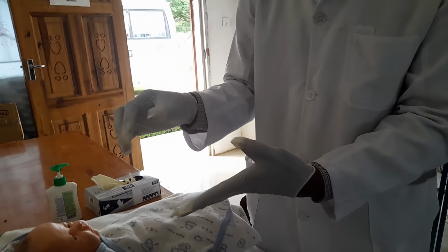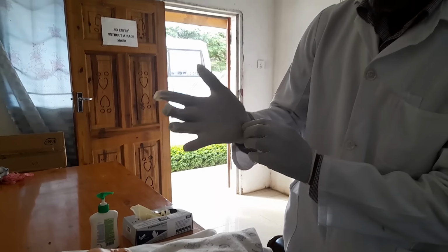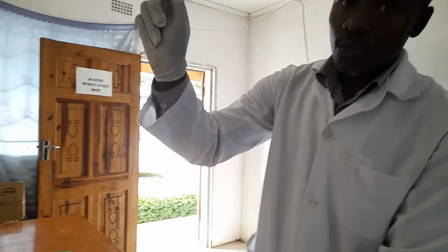In this case, the baby is on a resuscitator here. You're going to tell the examiner that you will switch on the resuscitator. So, "My examiner, I have switched on the resuscitator as well as the timer." By switching on the resuscitator, the heater will be functional so that you prevent hypothermia.